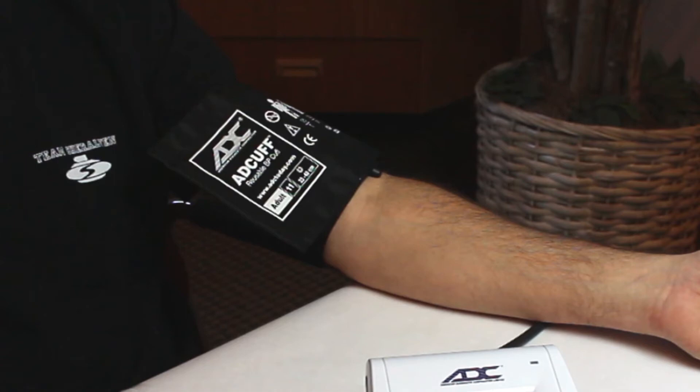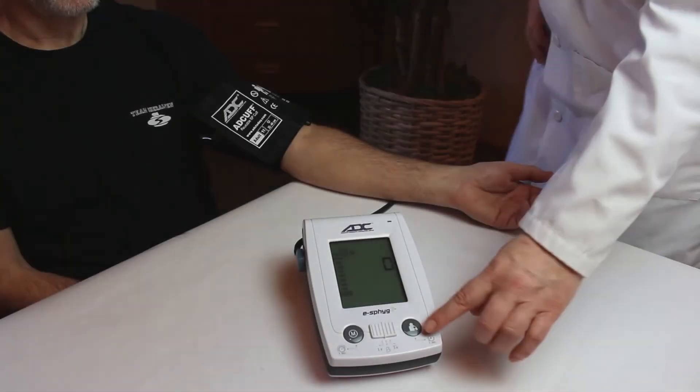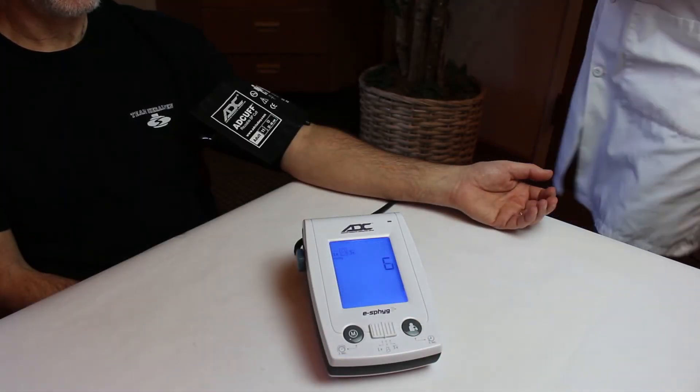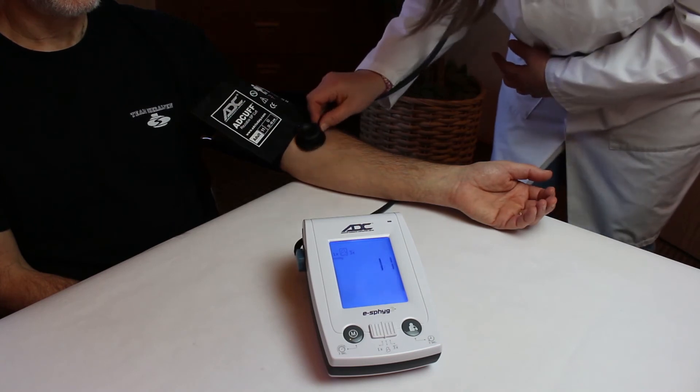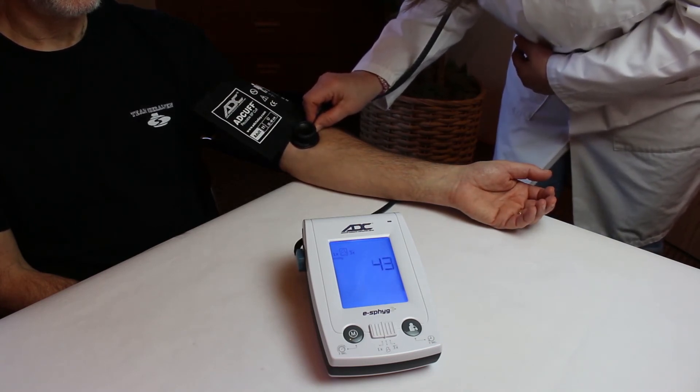Make sure the arm is relaxed and supported, and ask the patient to stay still and quiet. With the cuff in place, press the start-stop button. The cuff will begin inflating. While the cuff is inflating, position the stethoscope over the brachial artery, distal to the antecubital fold.